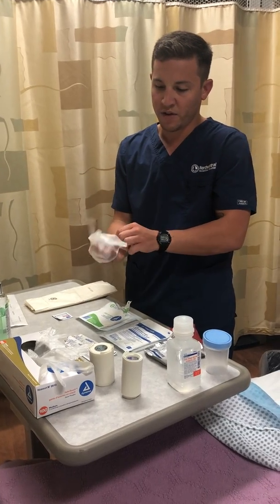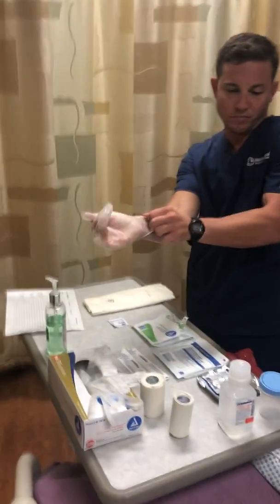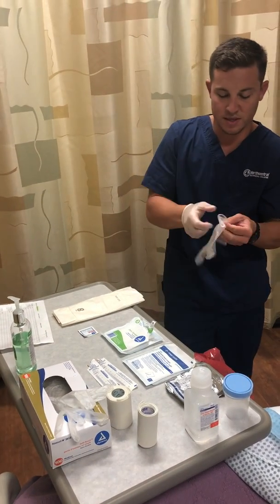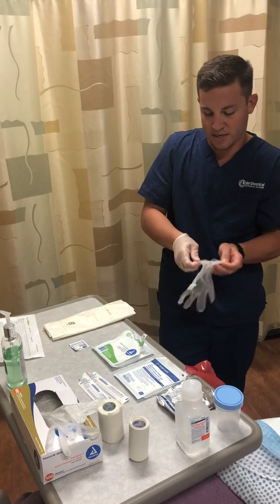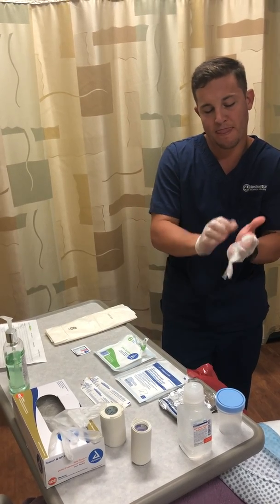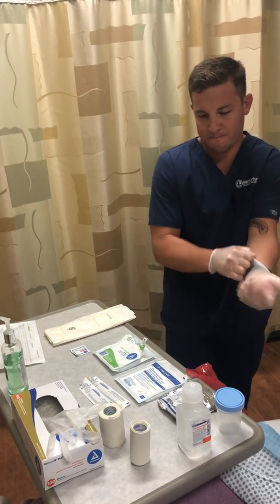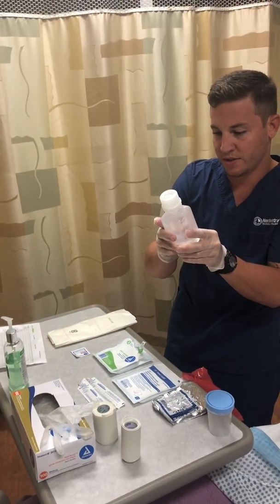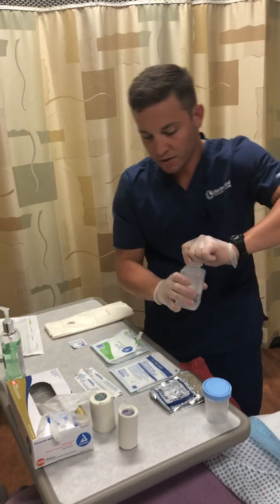Here we have normal saline, and we checked the expiration date on it. Expiration here, December of 20, so we're good.